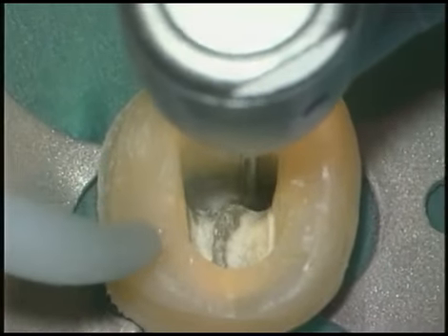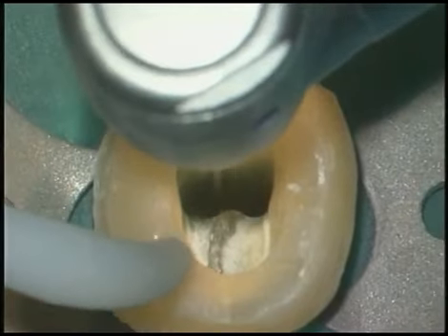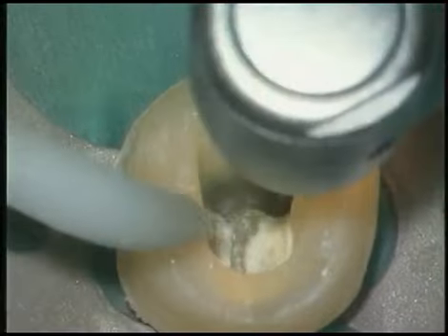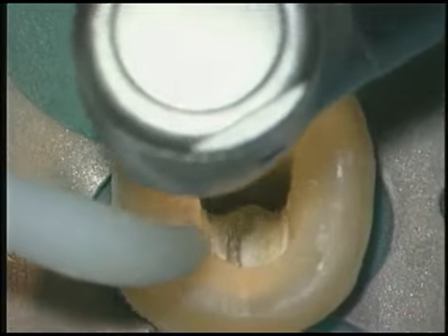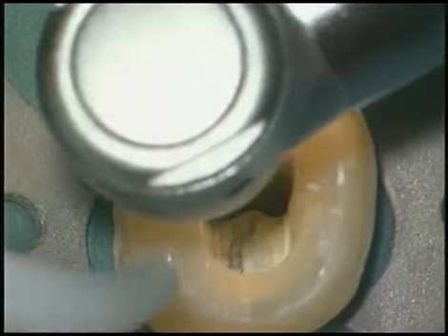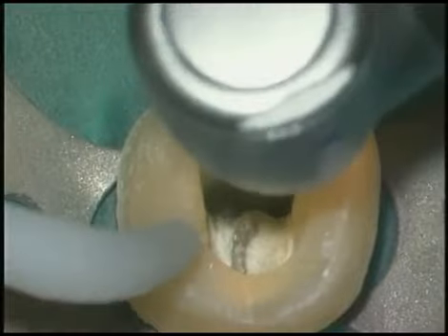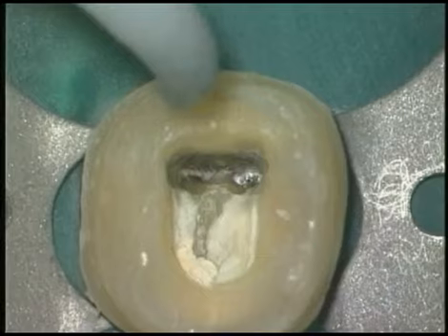Slowly and progressively, crown down, and we're going to need to crown down until we can visualize the top of the broken instrument. Ultrasonics can really only work in the straightaway portions of the canal. Ultrasonics will not be able to pass lateral to the instrument and around the curve. So if we can expose just perhaps 1 or 2 cutting flutes of the coronalmost aspect of the broken file, we're going to be in good shape.